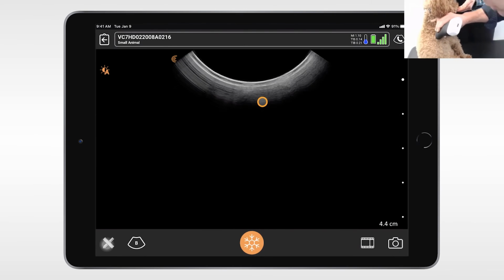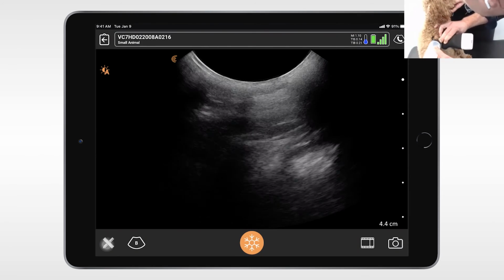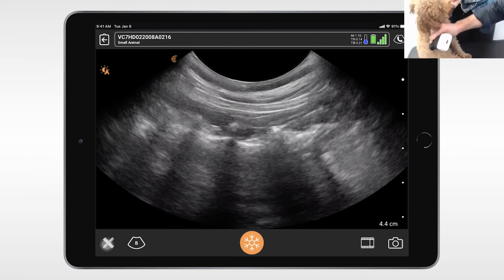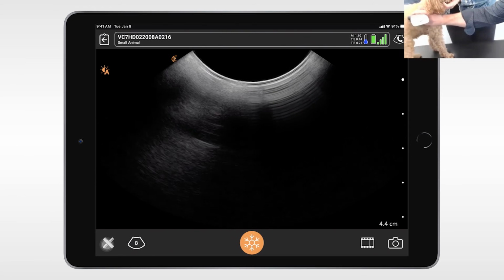I guess, do you alcohol all the way along to find it, or you can move the skin. So you wet one spot and you can move the skin backwards. That's another way to reduce the alcohol content. And yeah. Okay. Get in the abdomen. There's my curtain. There's my curtain.